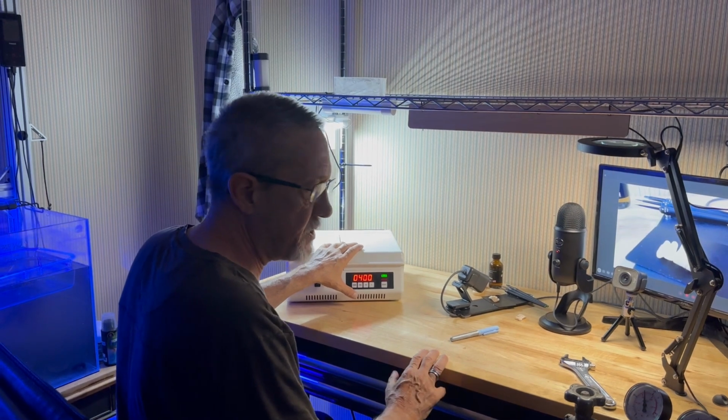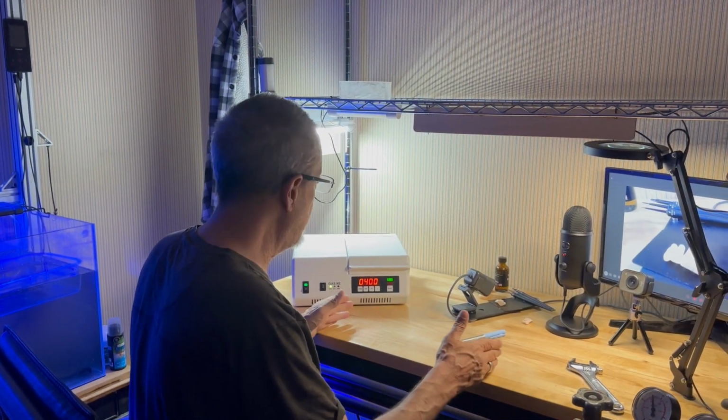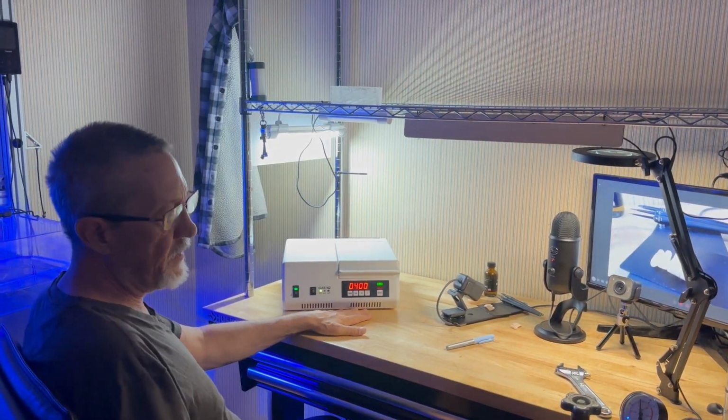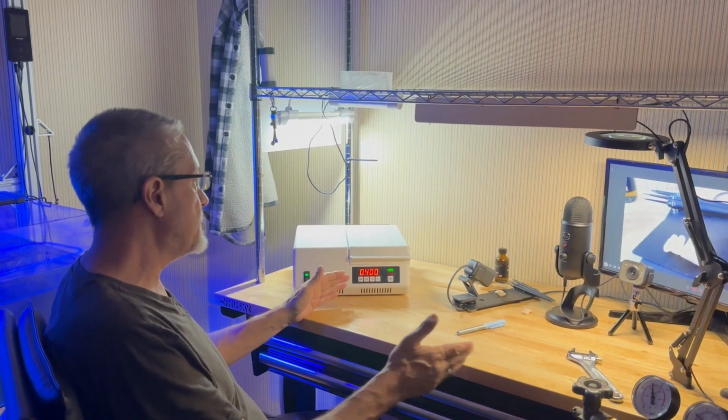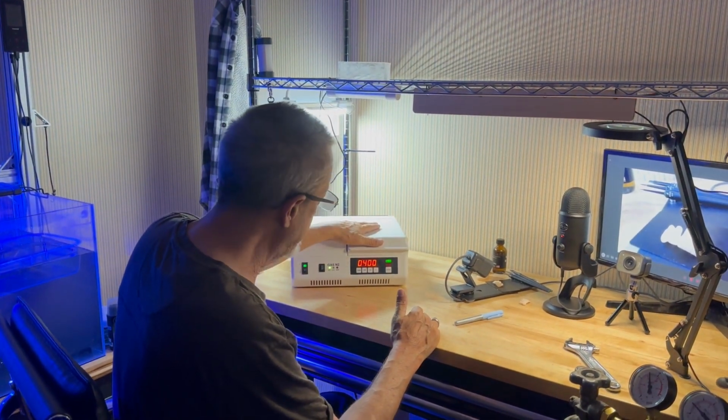If you've been to the course, you know that. Keep track of your flashes until you reach your maximum number of flashes. So if I do 2 stain sets, that's only 800 firings. I still need to hit 4,500. So do your math and add those up and make sure you hit your final cure flashes.